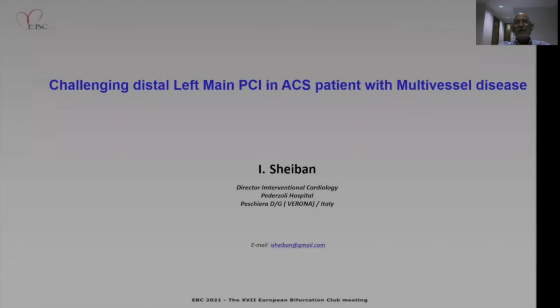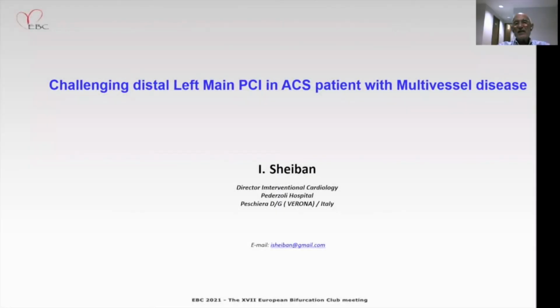Dear Chairman, thank you for the invitation to present at EBC 2021. Today I'm sharing with you a challenging case of distal left main angioplasty in an acute coronary syndrome patient with multivessel disease.